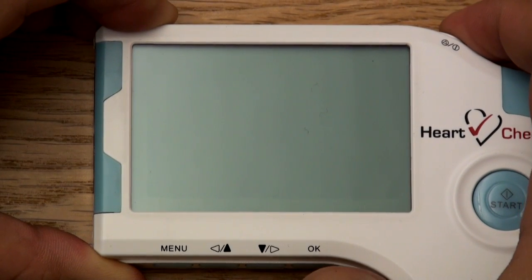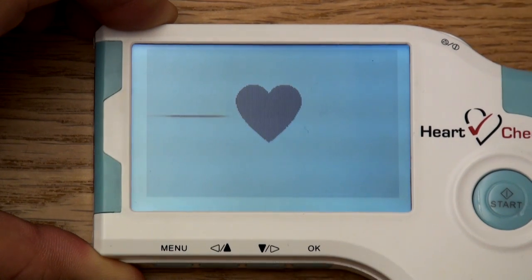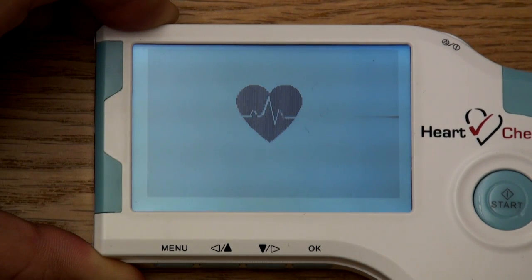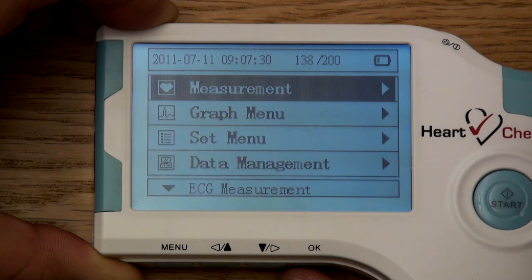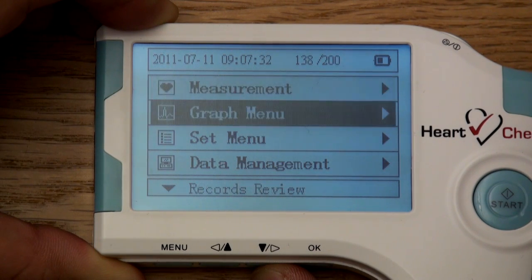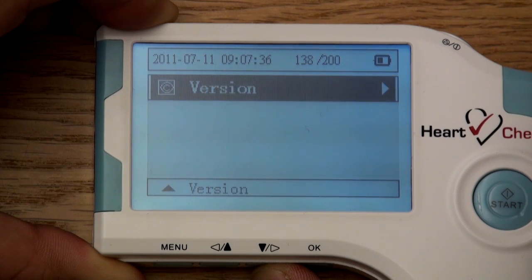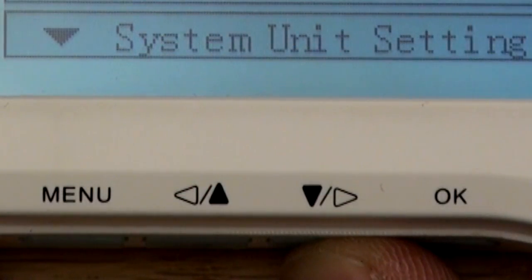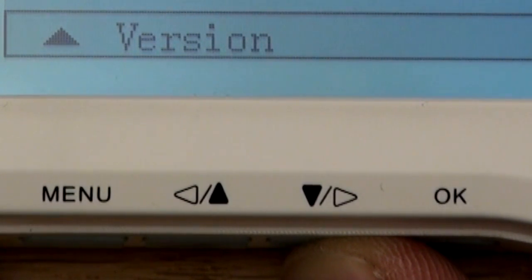Setting the date and time. Once the batteries have been installed or replaced, you'll need to set the date and time. To turn the device on, press the power button located at the top of the device. Once powered on, the monitor will display five main categories: measurement, graph menu, set menu, data management, and version. Use the up and down buttons located at the bottom of the device to scroll to the category of your choice.